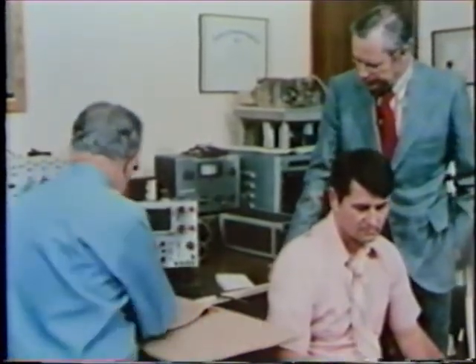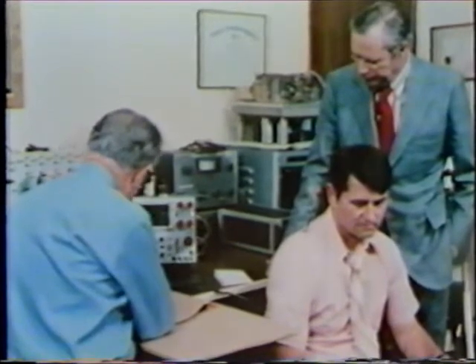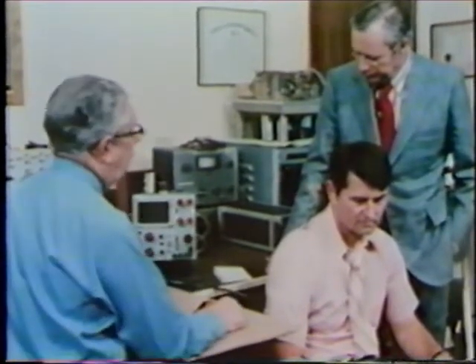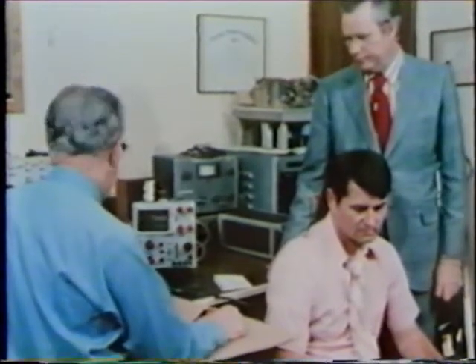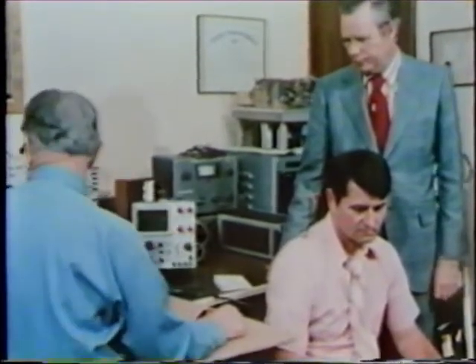repeated electrical stimulation. Go to fourth electrode, number 4, the yellow electrode. Okay. Which is the second one up from the round window.